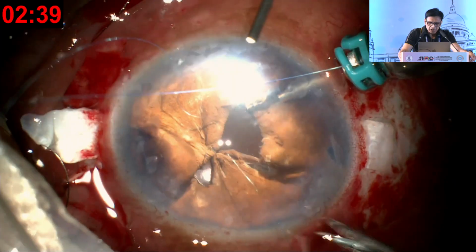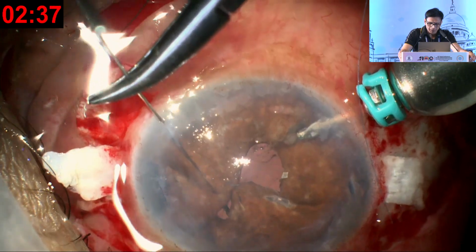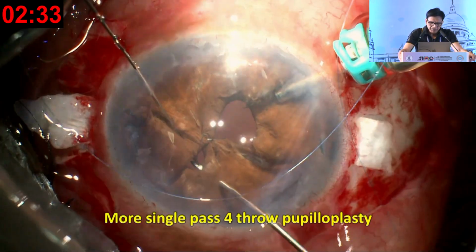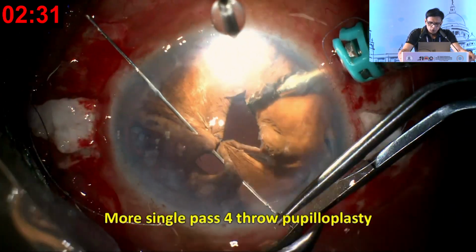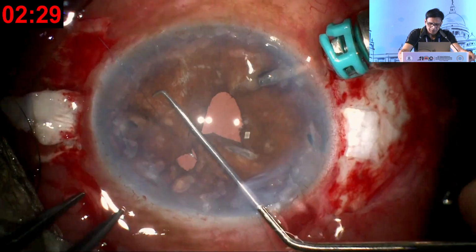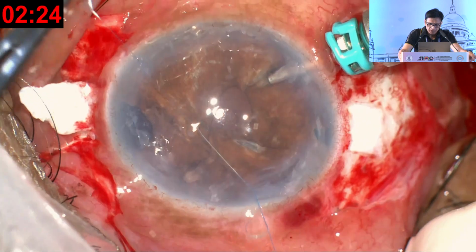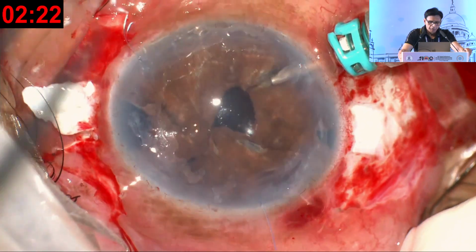So I suggest all of you move on to this 4-throw pupiloplasty. Once you have done more and more, you will find life very comfortable. Here you see more of the single pass 4-throw pupiloplasty being done. The advantage here is it's a very simple procedure which anyone can follow.